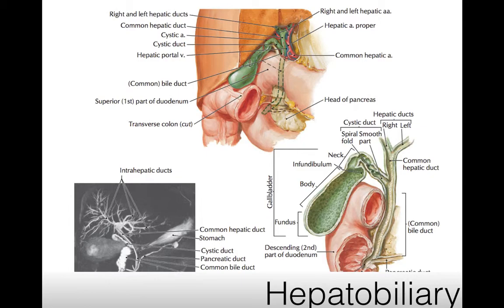So we look at the anatomy. The gallbladder just hides behind the liver. Sometimes it is even higher, especially in adult patients. The gallbladder has the cystic duct drainage, which combines with the common hepatic duct to form the common bile duct. When we scan these areas, we may identify the gallbladder, the liver, and sometimes the duodenum, where gas and motility can sometimes cause confusion.